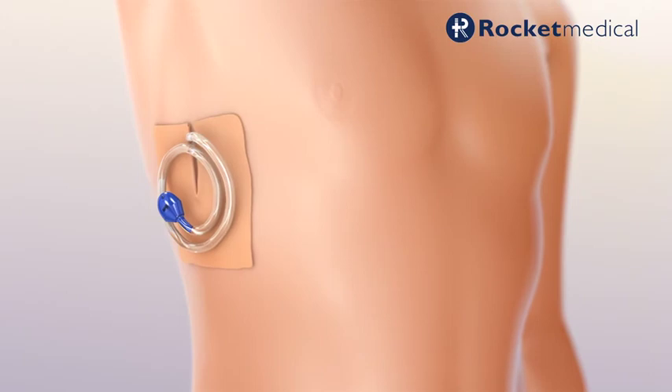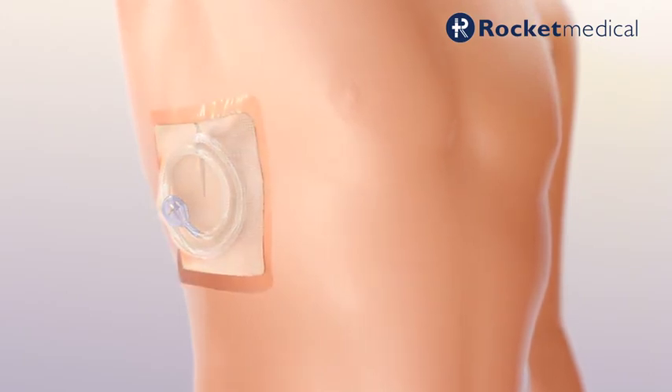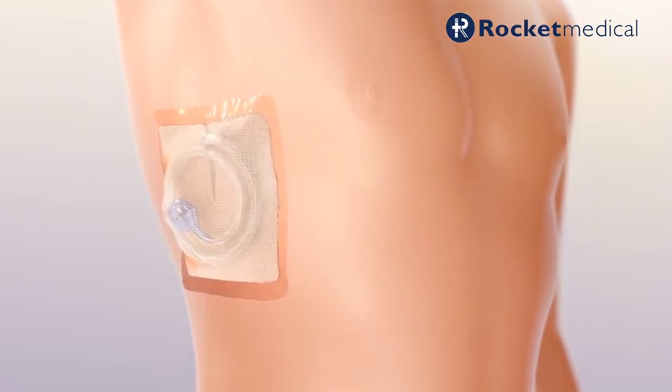For the ongoing treatment of patients with recurrent pleural effusions, consider the implantable Rocket Medical indwelling pleural catheter to provide a long-term drainage option.